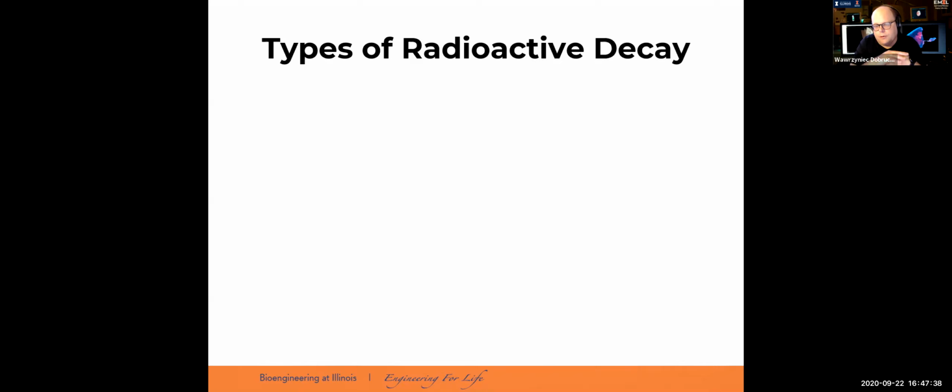The radioisotopes emit positrons, which then go through an annihilation process with an electron, and the resulting energy is detected by PET detectors to create an image. But we'll talk about this on Thursday.